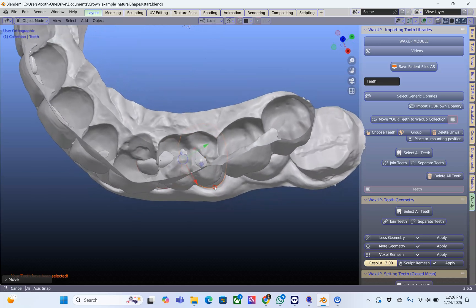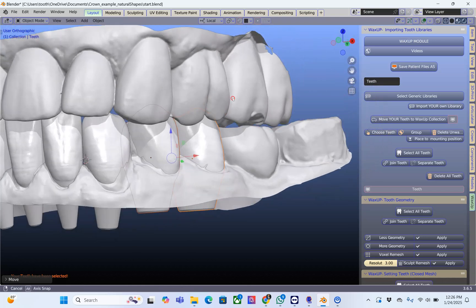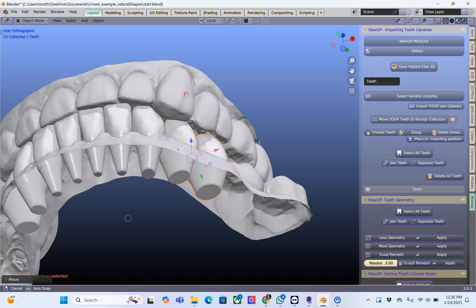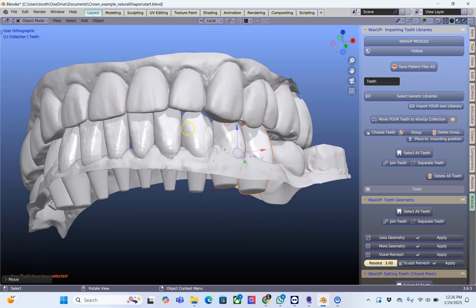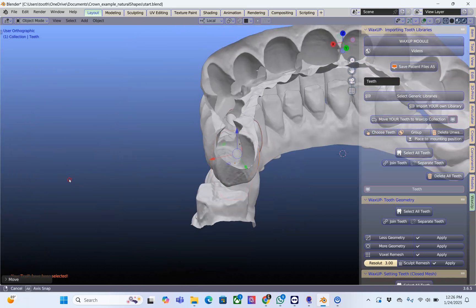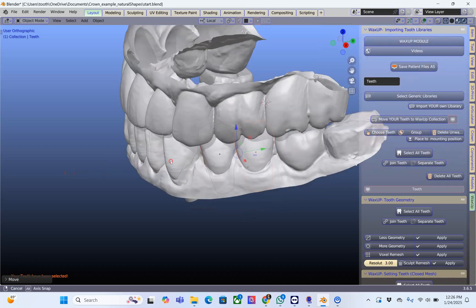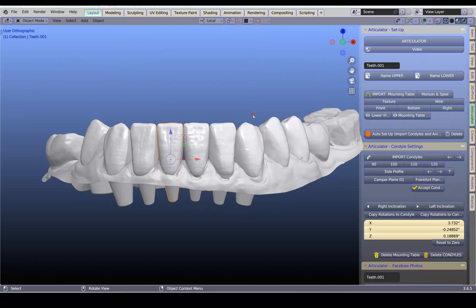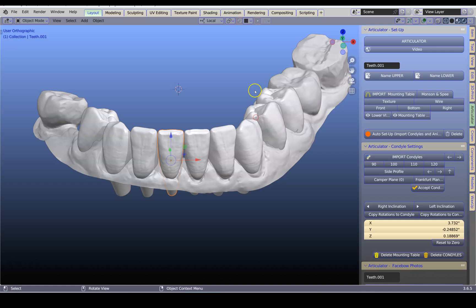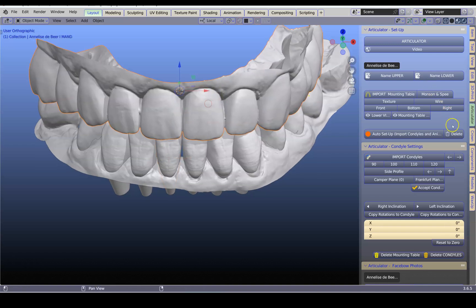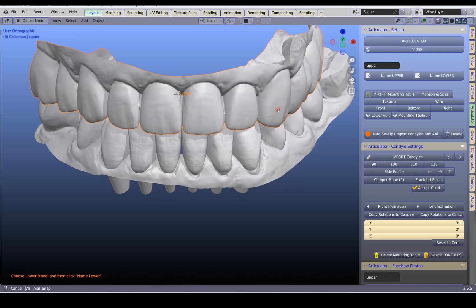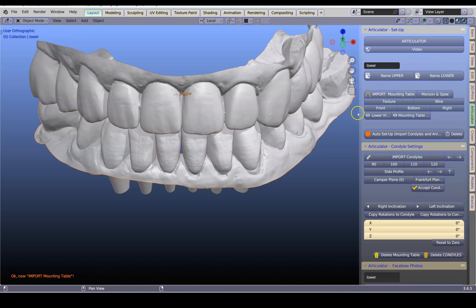Other than that I think it's looking quite good and I will probably proceed with grinding those teeth down. We're going to use Alt H to unhide. This is my upper model named "upper articulator setup" and this is my lower model named "lower," and import the condyles.